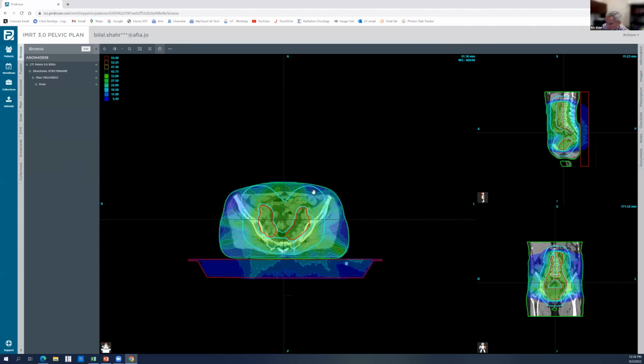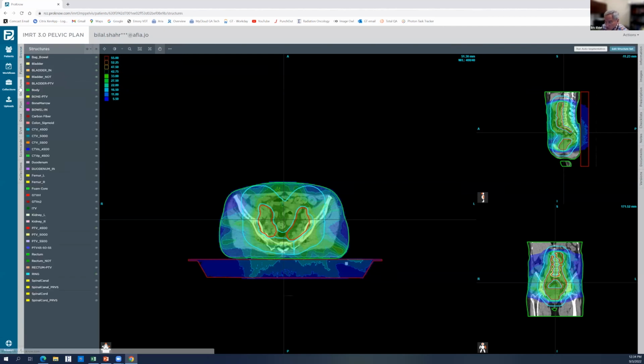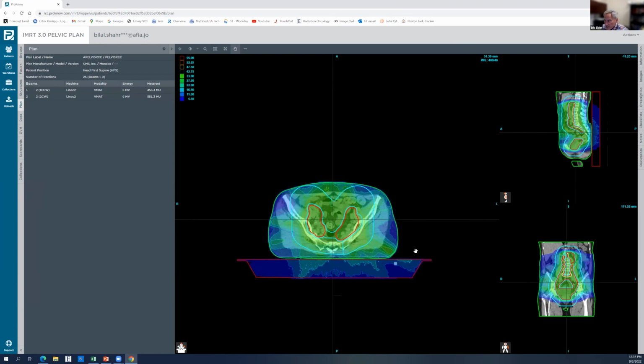The one thing I want to point out is this plan does have a ring, which is a nice thing. It's got a ring, but we still seem to get a lot of dose coming out here. This is a VMAT plan, and you would usually see this with IMRT, but we're seeing a lot of dose coming outside in here. So it might be that we really should force this into 2 rings and force that dose down faster. It may be struggling with the ring so thick to limit your dose outside the field. But this needs to be dealt with, because this is 33 gray on the outside, which is a little excessive. So, Sean, anything else?